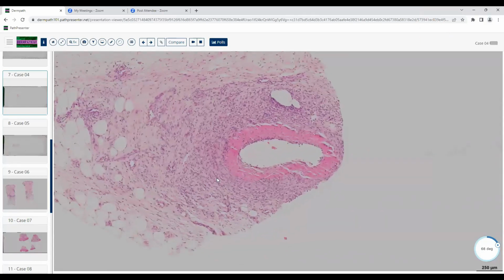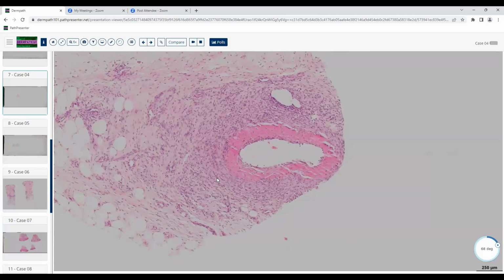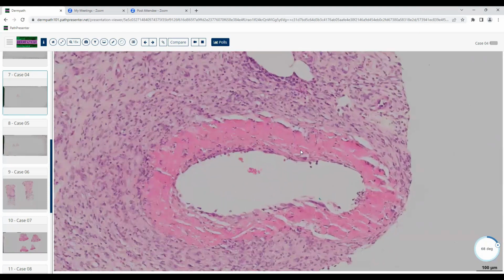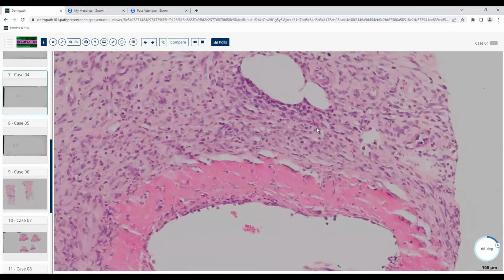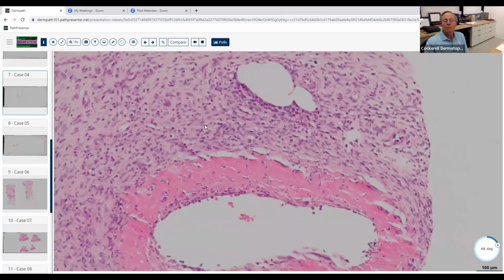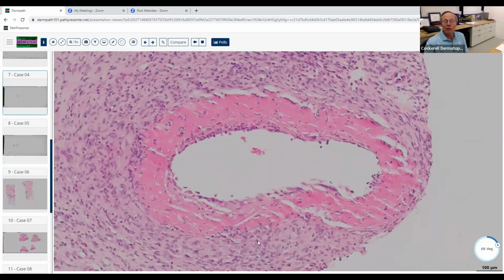And then another way we can classify is looking at the types of inflammatory cells around it. Good. So I see some neutrophils, some lymphocytes. Yeah, I see a lot of neutrophils here. There's maybe even an eosinophil here. What if we saw a lot of histiocytes here? It looked granulomatous. What would that make us think of?